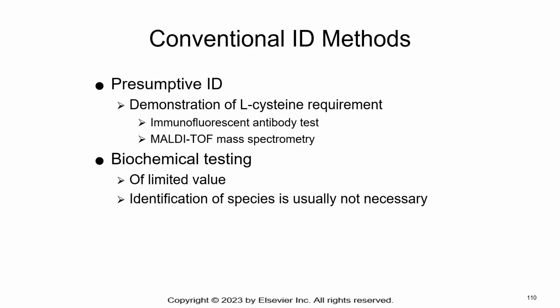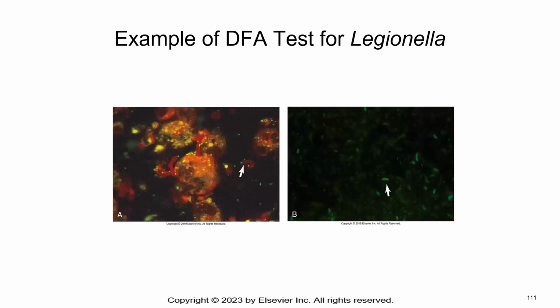So MALDI-TOF is used for identification, and biochemical testing is not really used any longer. There's also DFA, direct fluorescence antibody testing for Legionella, and when using specific antibodies designed to attach to or bind to Legionella, you can see how they fluoresce.